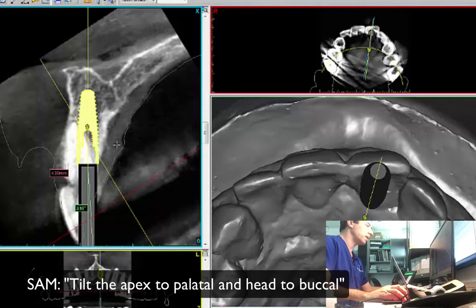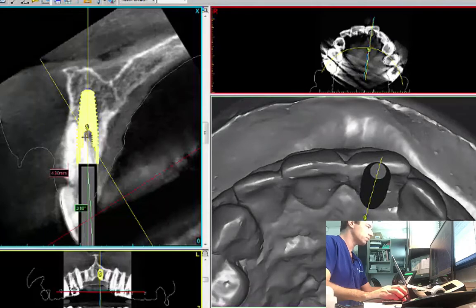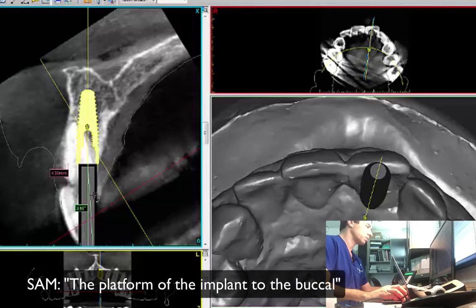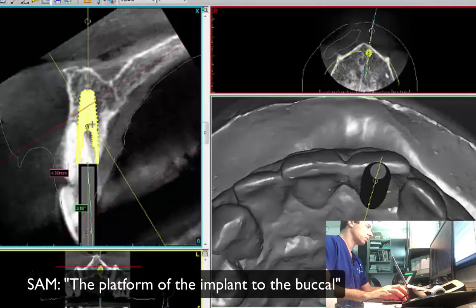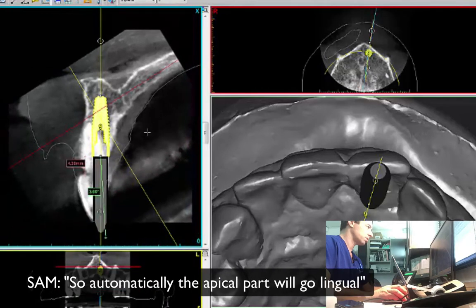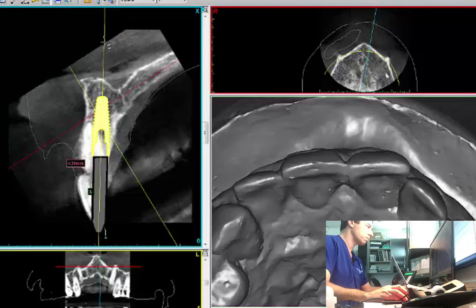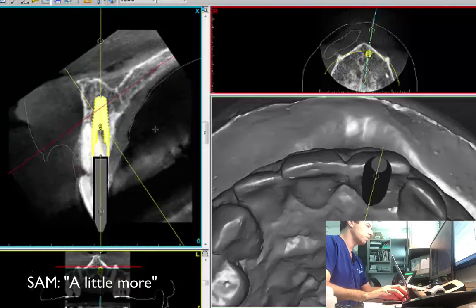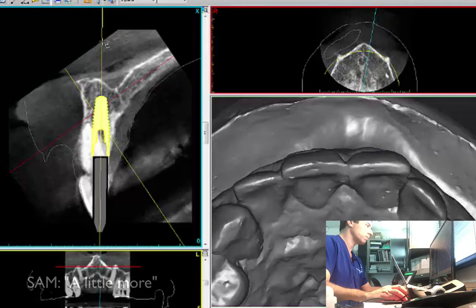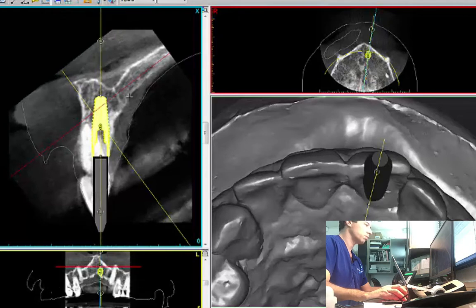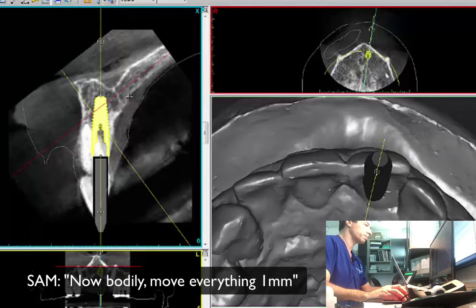You want the head of the implant — meaning the platform or the apical part? No, the platform of the implant more towards the buccal, so automatically the apical part will go more lingual. Okay, exactly. A little more. A little more. And then now possibly move everything a millimeter.